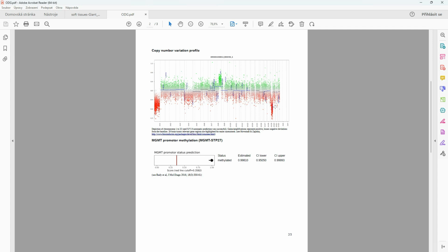So we didn't perform FISH studies because it's very clear that the tumor has co-deletion of 1p and 19q, and this really confirmed the diagnosis. IDH was negative by immunohistochemistry, but positive by PCR testing. So the tumor had an alternative, less frequent IDH, I believe IDH2 gene mutation.